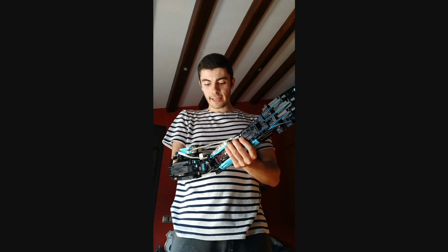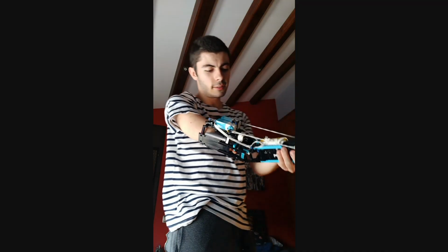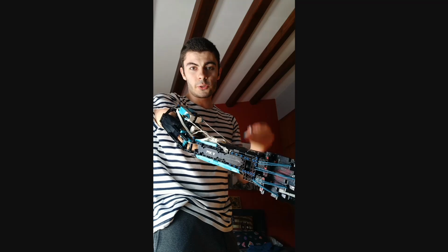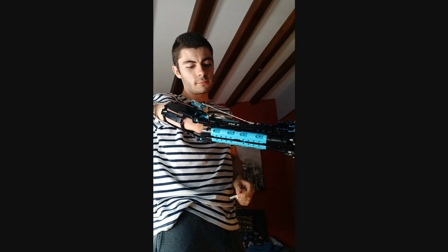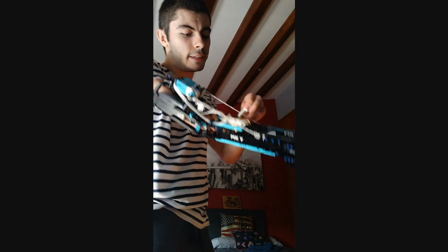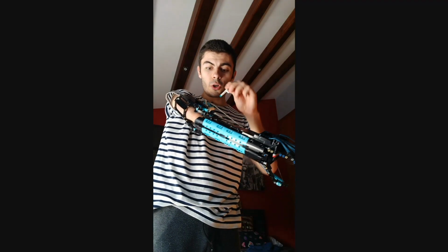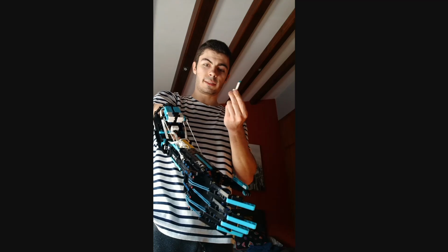Okay guys, we finished the prosthetic. Congratulations, you managed to get to the end of the video. And yeah, I'm just going to show you how I use it and how to turn it on. So first of all, as in every prosthetic that I've built, I put the arm inside this bracelet, I like to call it. And now we are going to use the brick that's in the instructions to turn on the hub. Okay, and by default, you don't actually see it, but if you go right here, there's a little light that shows what program is running right now. So I only need to go to the right one time on the program number 1 in order to activate my software. And now you can actually put this back in place.